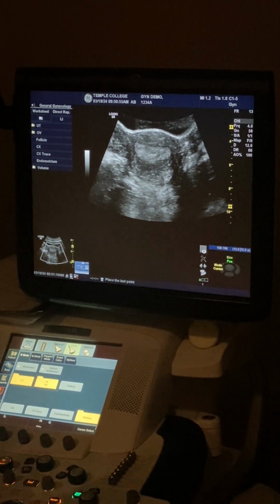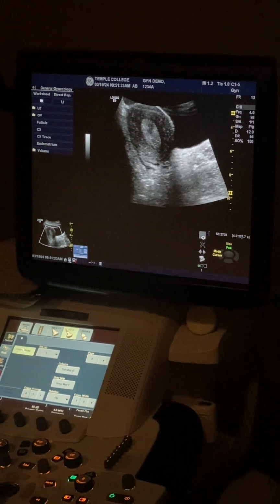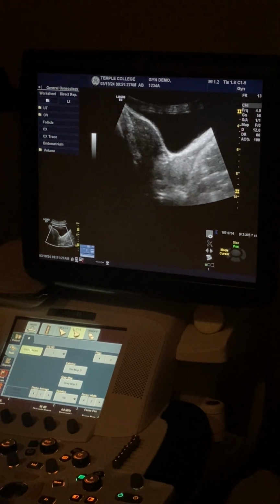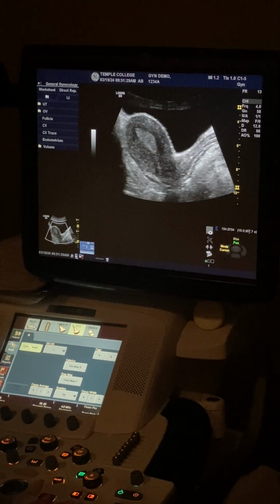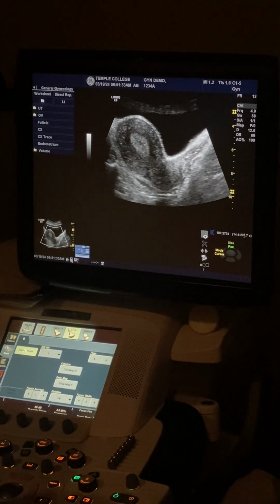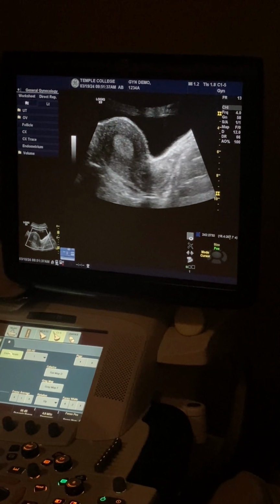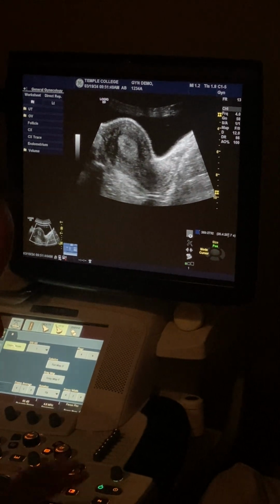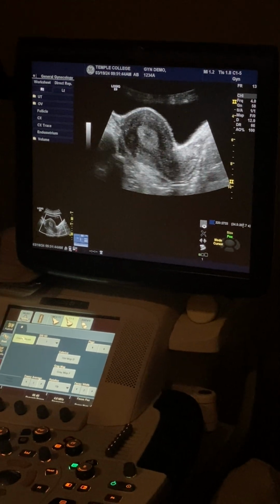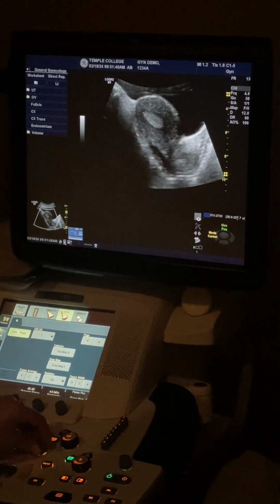When you're doing long endometrium, you just want to lengthen it out as best as you can and get that thickest portion there. Okay? So I'll come out to the side, and now look how I can make it all connect. Bring the cervix in. Does everybody see it? And this is just a constant little twisting and tweaking. It's not true long, right? That's long on her uterus. Let's see her gorgeous ovaries.